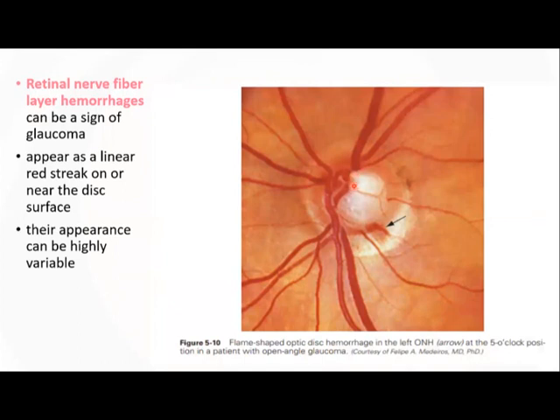Sir, this one, temporally, right side to that. That is the vein. That vessel we have to see in the slit lamp with a three-dimensional view. That will be bared out. It is not excavating. It's not following the contour of the cup.